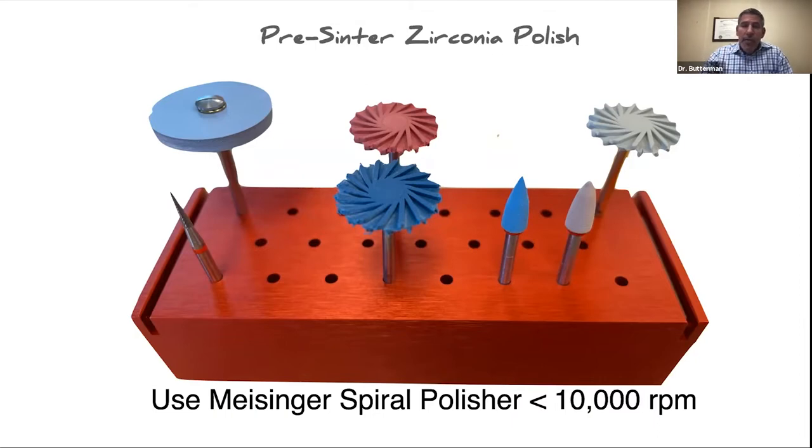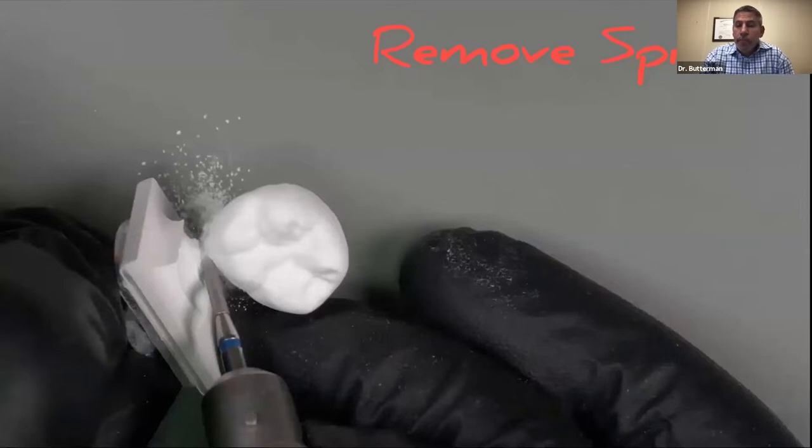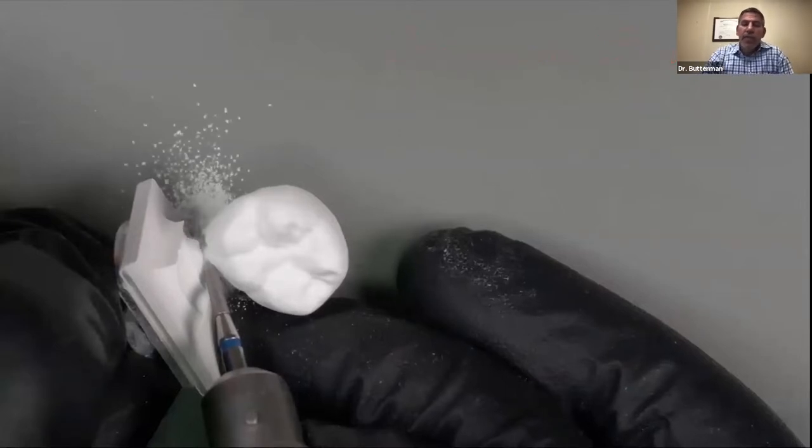But the cool thing about this is that we have relatively few instruments. So we're going to be able to separate the restoration from the block. We're going to be able to remove the sprue. We'll be able to pre-polish, we'll polish, and then we'll do a final polish. And then we'll go over it one last time when it sinters. So let me show you what I'm talking about. And just let me know if these videos are playing well.